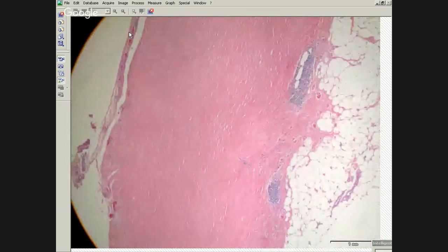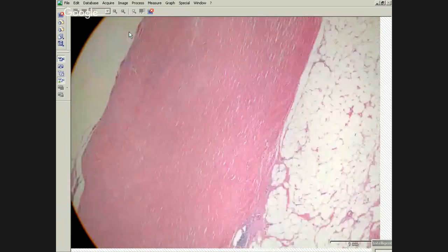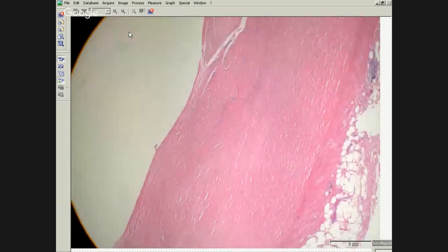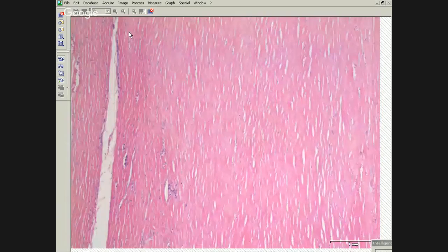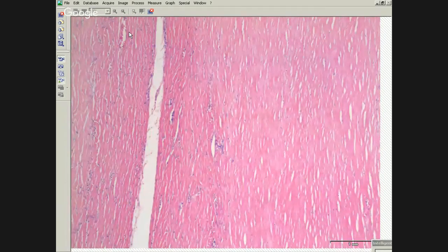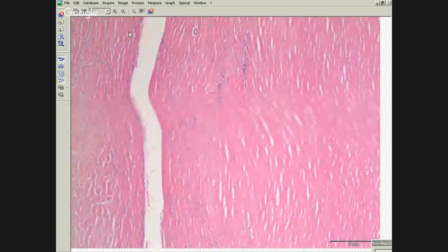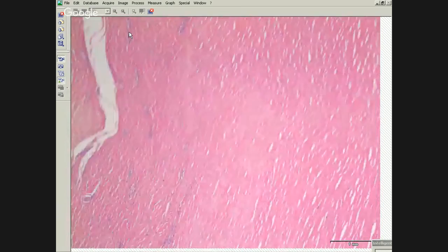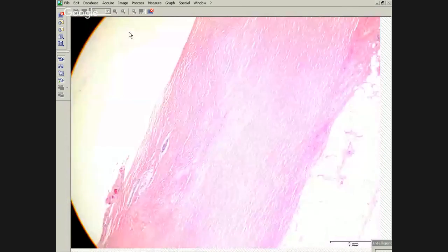But this is all very linear and uniform, and sometimes you can have mesothelial cells entrapped in here. If you get a keratin on this, it would be a little more shocking than you might expect, but even the mesothelial cells will maintain a linear orientation. So they should be parallel to the direction of the pleura.